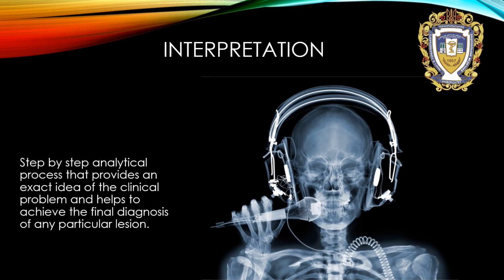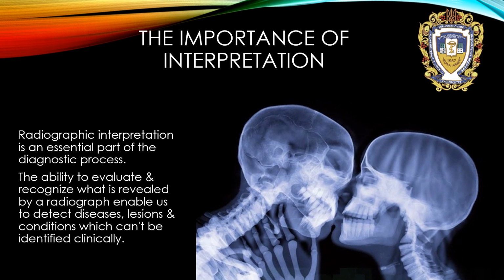Step by step, an analytical process that provides an exact idea of the clinical problem and helps to achieve the final diagnosis of any particular lesion. Radiographic interpretation is an essential part of the diagnostic process. The ability to evaluate and recognize what is revealed by a radiograph enables us to detect diseases, lesions, and conditions which cannot be identified clinically.